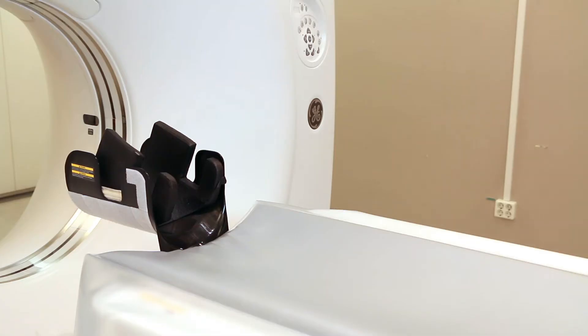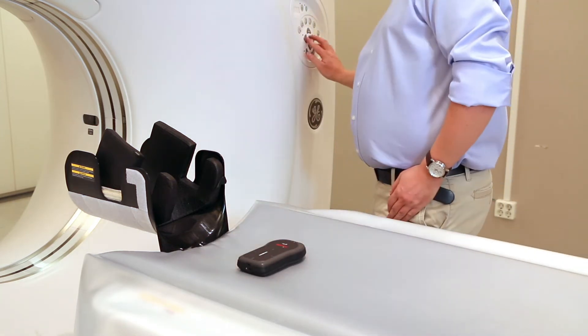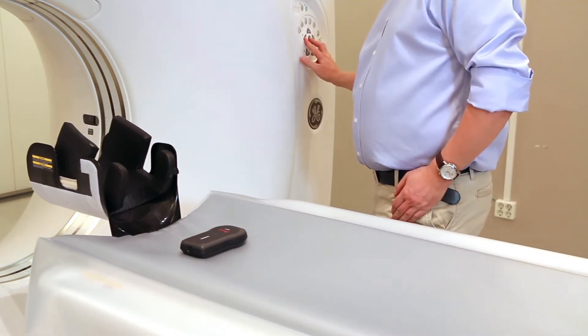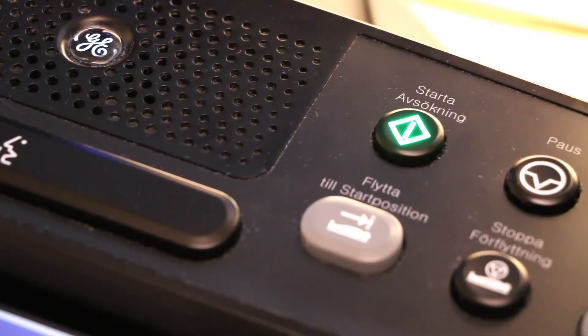Hi, I'm going to show you a tip on how to measure kilovolt on a CT machine using your black piranha. One way to measure kilovolt on a CT machine is to place the piranha on the table, go into service mode, turn off the table speed, and then make an exposure.